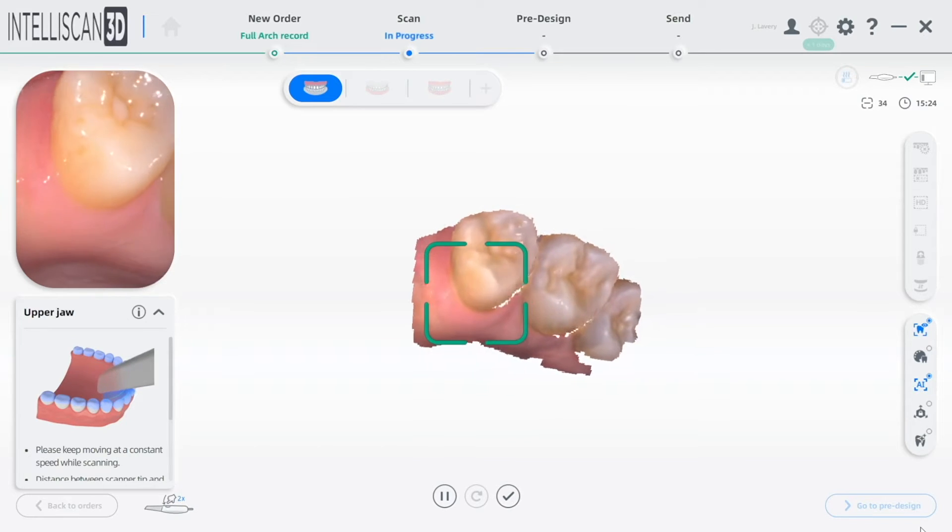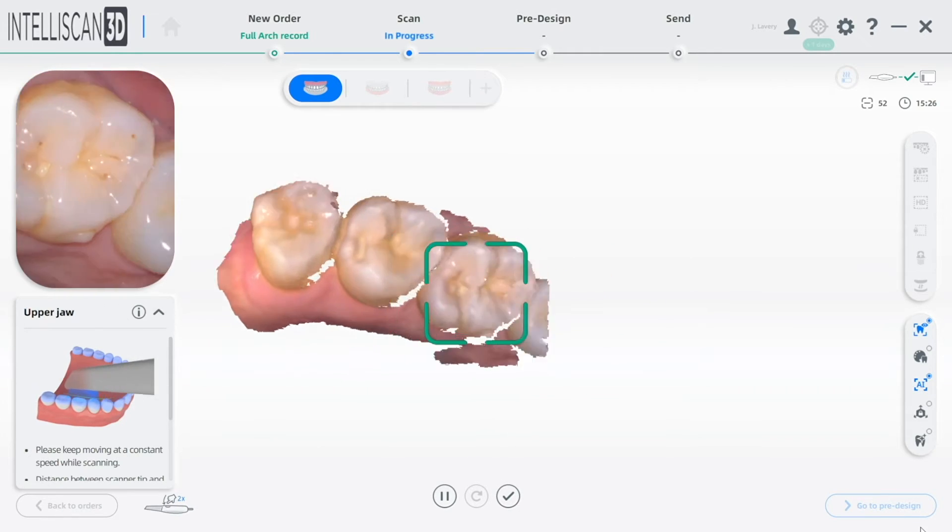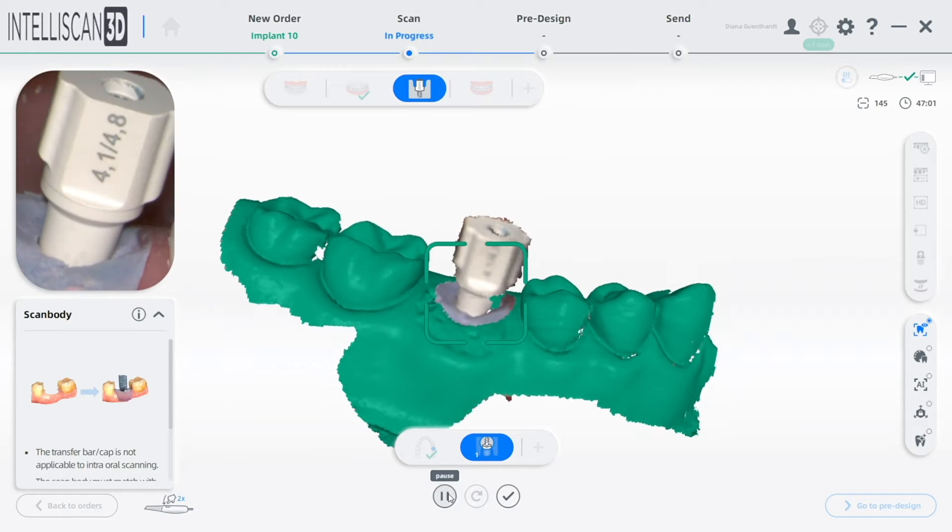The IntelliScan Model X not only has restorative, orthodontic, and implant workflow modes that are standard — IntelliScan Model X also comes with a treatment planning oral health check mode. This is revolutionary.